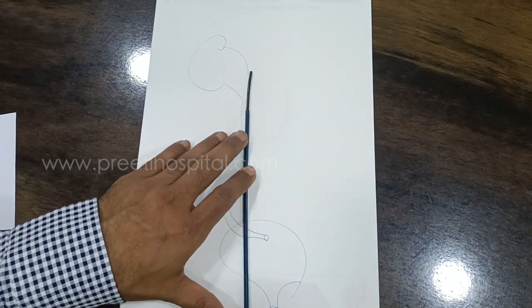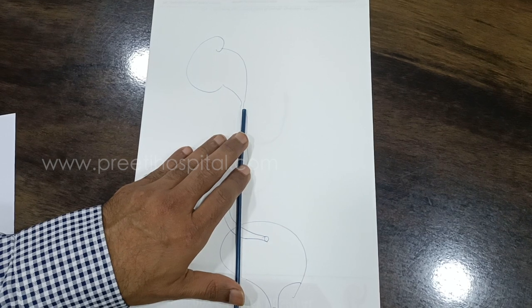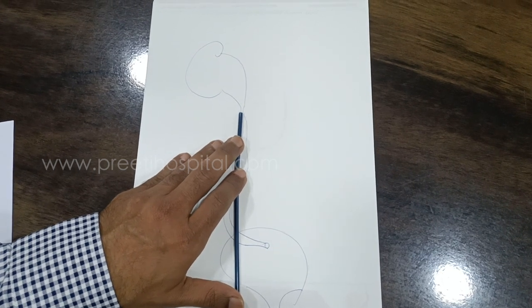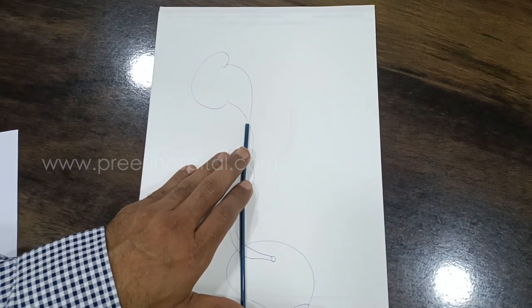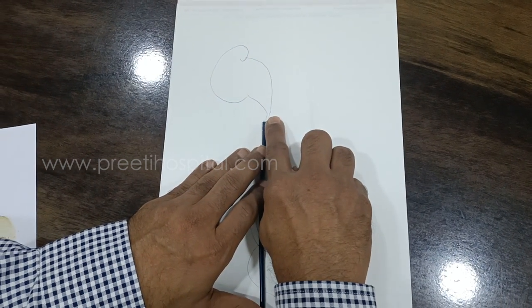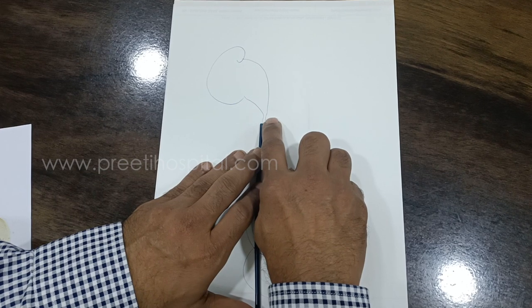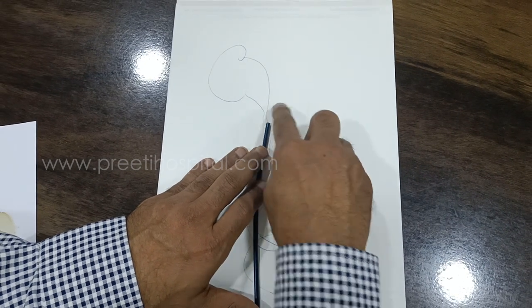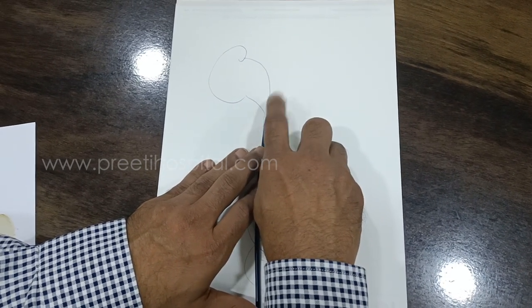Somewhere between the sacroiliac joint to transverse process. By chance, if you put access sheet very high, when you remove this flexible scope and if somebody moves this assistant or you move inadvertently, this area is very thin and curved. If it damages, it causes stricture and that stricture is difficult to repair.